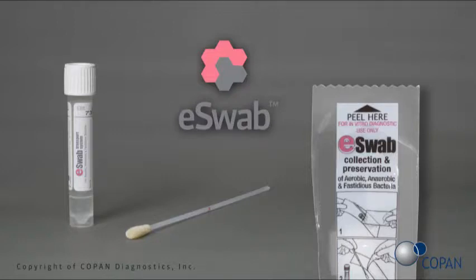E-Swab is a multi-purpose collection and transport system intended for any sample that you would normally collect with a standard sized swab, such as nose, throat, wound, rectal, and other sample types. This is not to be used for situations when one needs a mini tip swab, NP, or urethral samples, for example.